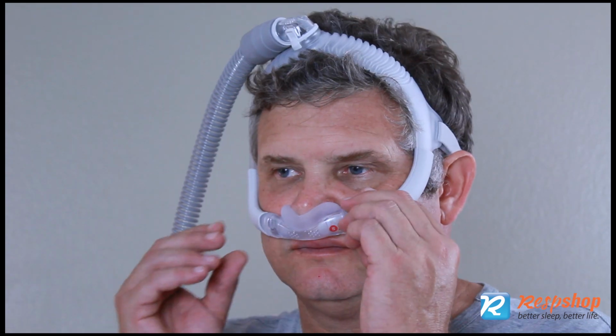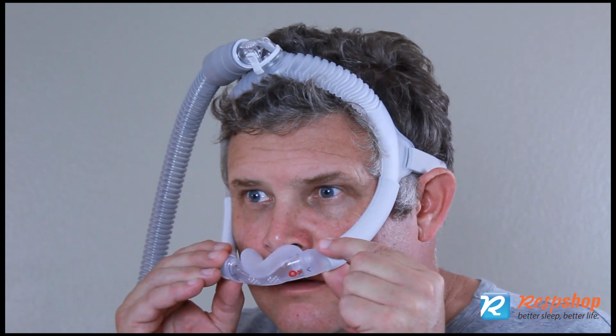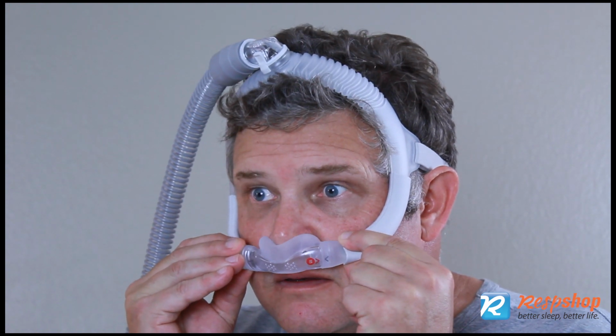The first thing to try is gently pull the cushion away from your face. Leave the headgear in place and just raise the cushion slightly. Sometimes silicone gets crimped, and this simple action unwrinkles it, smooths out the cushion and seals the leak. Raise it, replace it, and reevaluate.